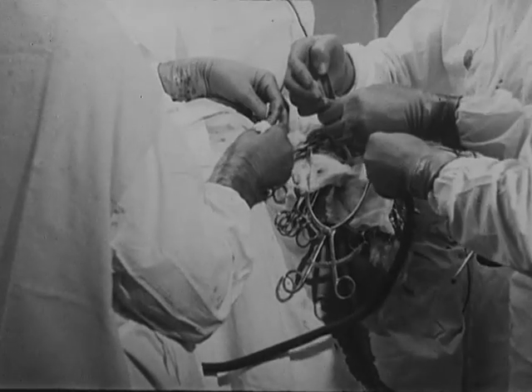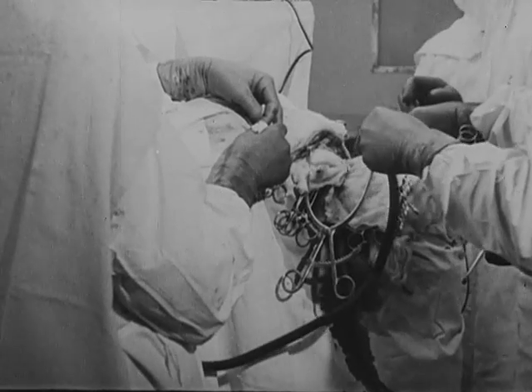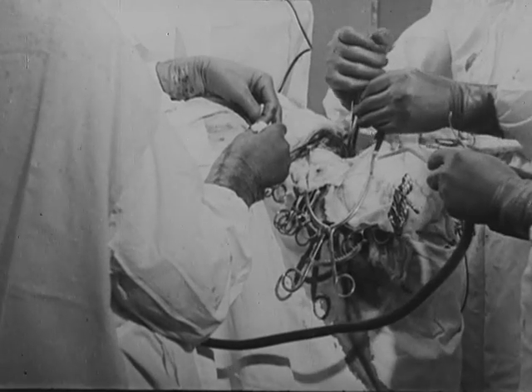Not only has the method proved a benefit to the patient and the anesthetist in the protection it affords to the airway, it has considerably increased the scope of surgery in the region of the head and neck.